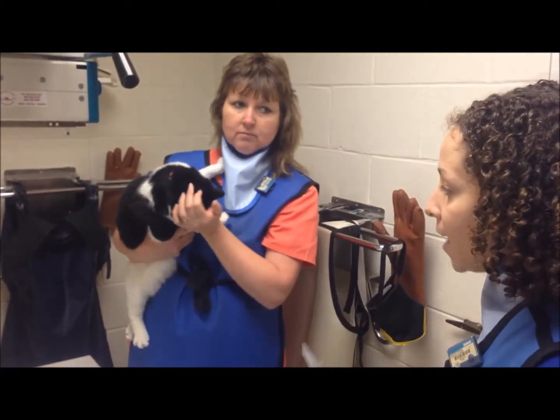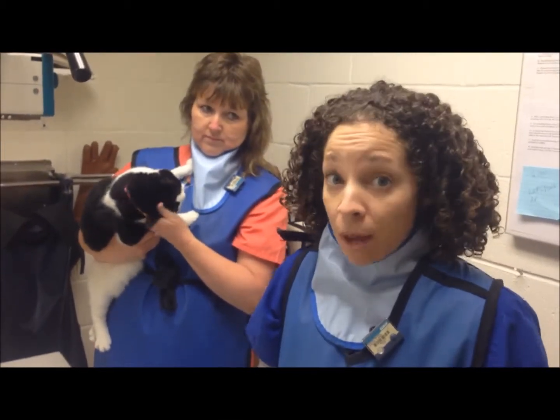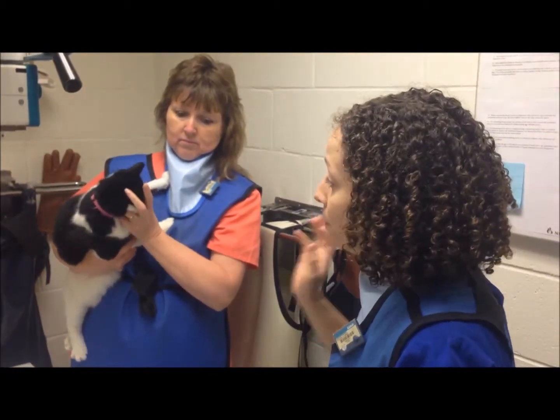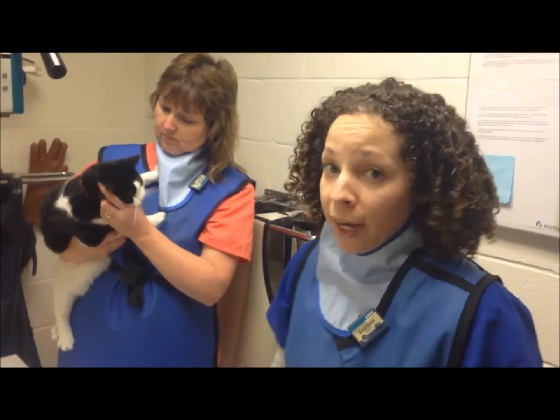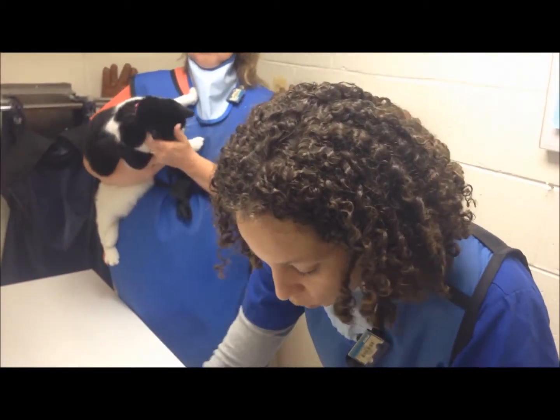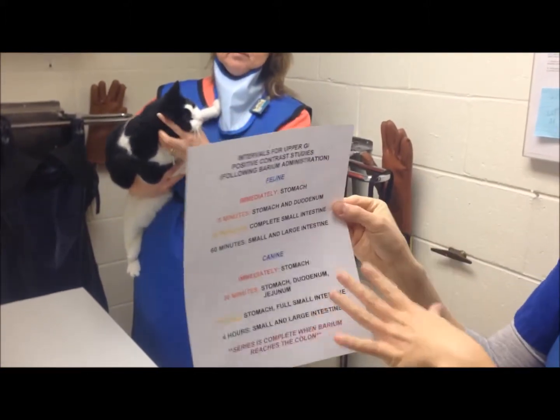Because cats have such a fast transit time, to get the contrast study of her stomach, we need to take the first x-rays immediately. So we'll administer the barium and then immediately take 4 views of her cranial abdomen. We want both the right and the left lateral, and then a VD and a DV. And then after that, we will take her following x-rays for the study at these following intervals.